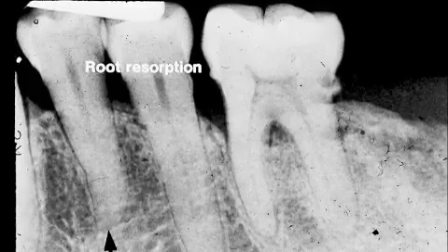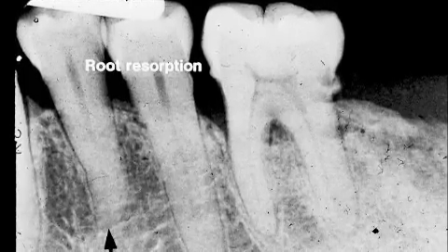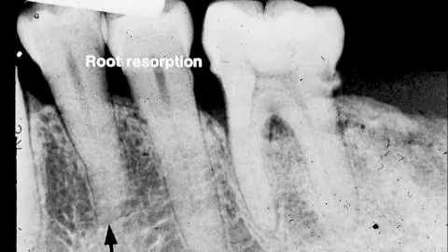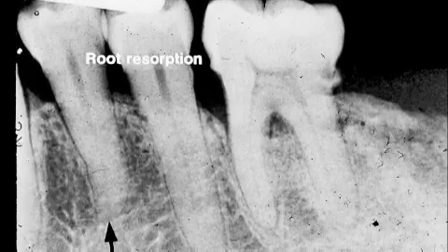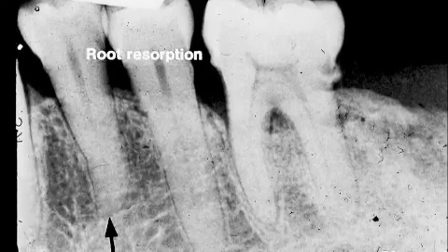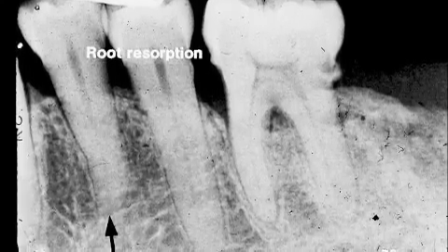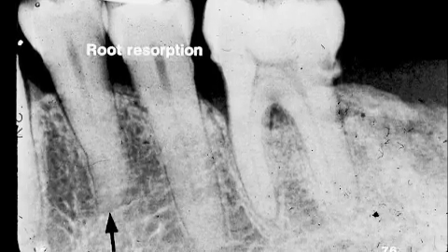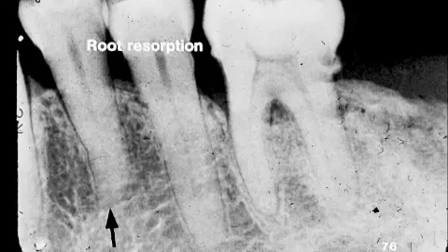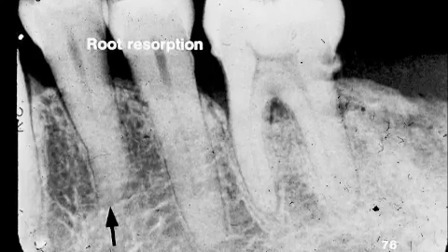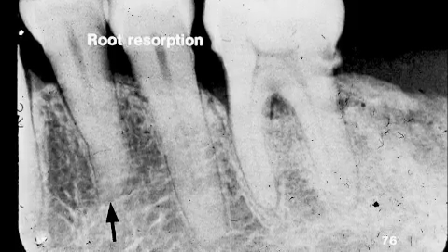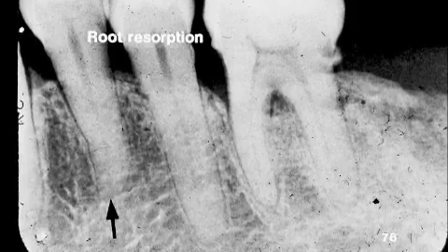Tooth number 21 shows external root resorption. When we compare the length of tooth number 21's root to the length of the root for tooth number 20, we will notice that the root is shorter and blunt. This is an indication of external root resorption.